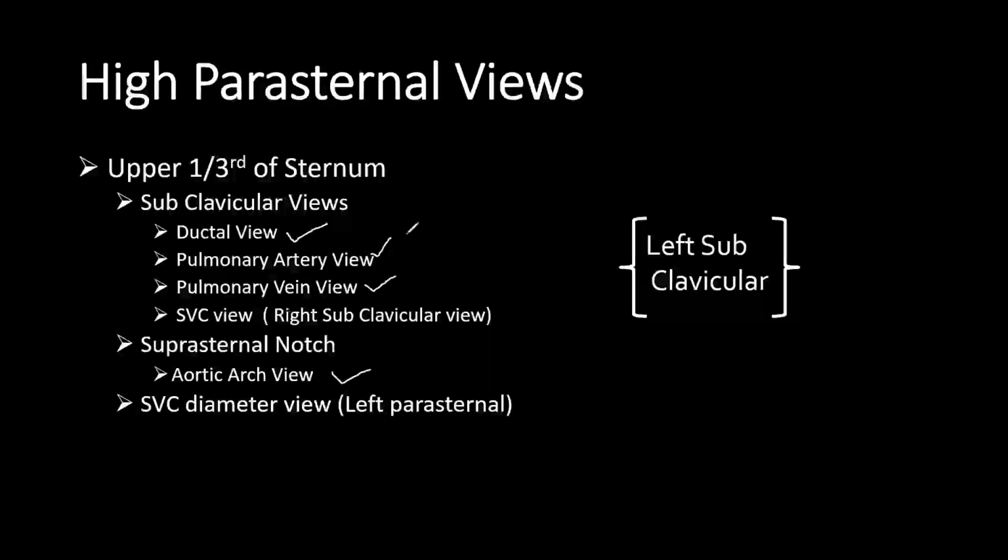So to understand this, you should remember one thing. Suppose this is a baby head, neck. This is the baby's chest. This is suprasternal notch. This is the sternum.